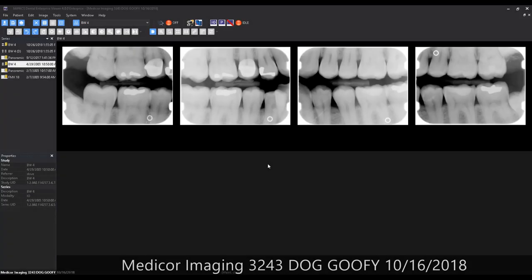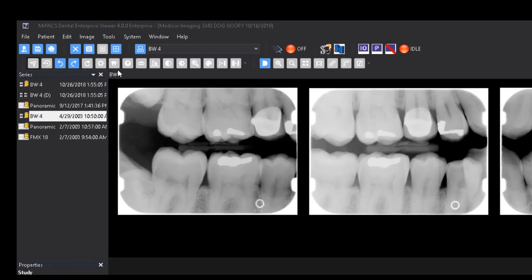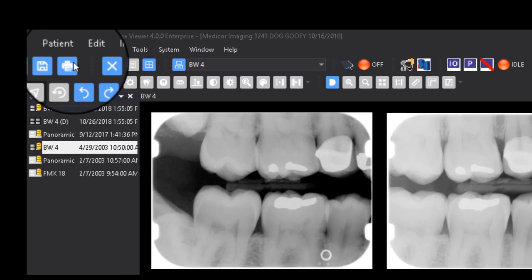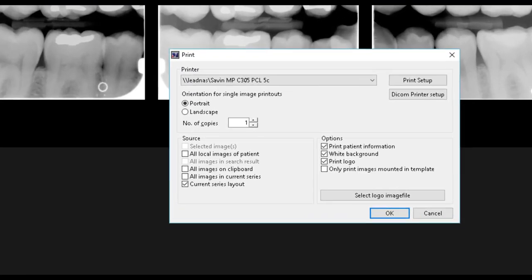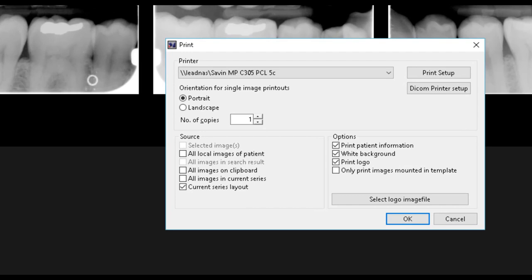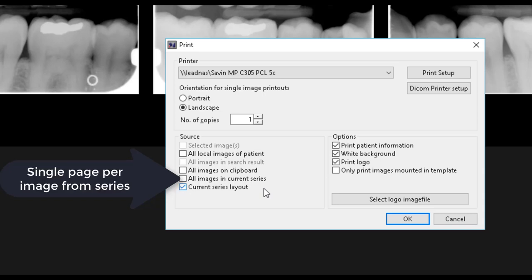The MyPax viewer can also print images. Select a series or individual images and click the printer icon on the toolbar. You can change the orientation of the printouts as well as the number of copies to be printed. You will also need to select a source to determine what will be printed. Be sure to select current series layout to print out the images as they appear in the template view.